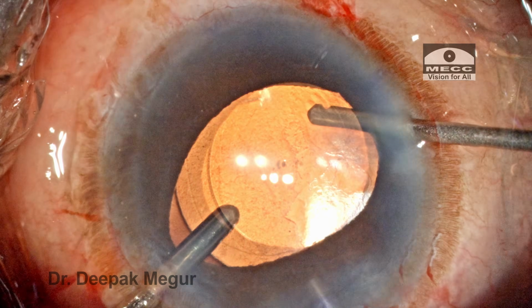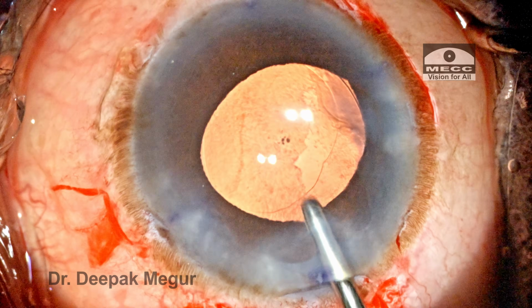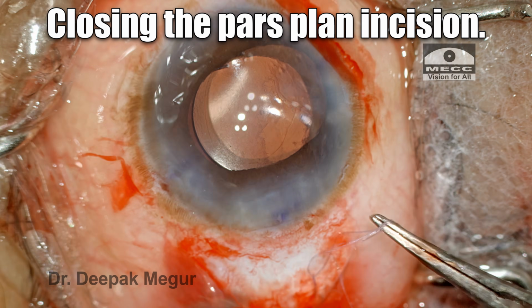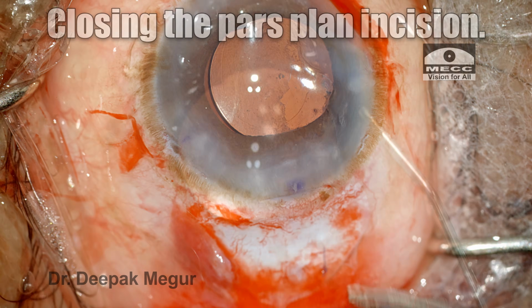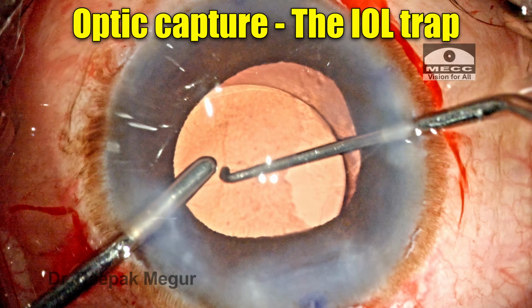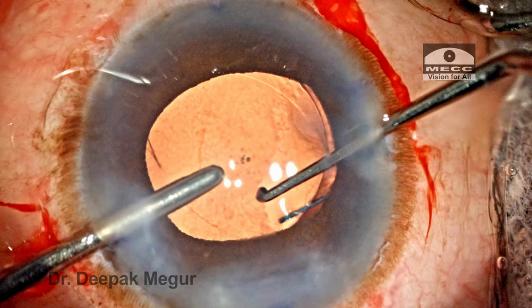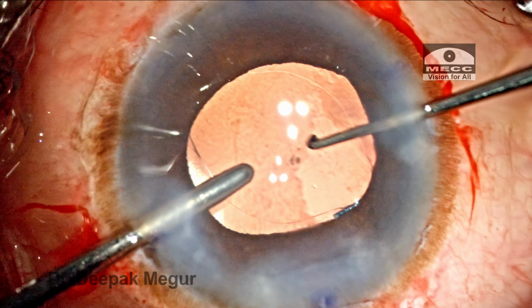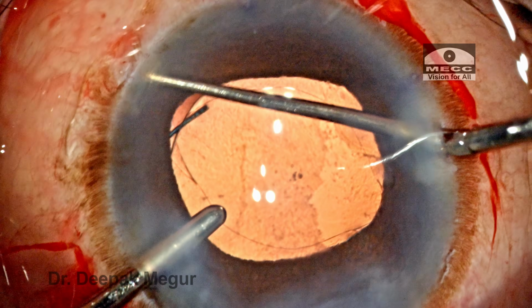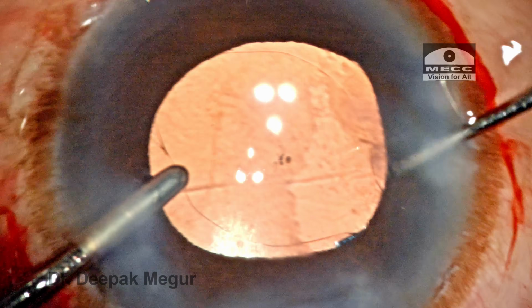So now the OVD and the vitreous have been taken care of. The OVD in front of the lens is now aspirated out. The vitrectomy port is sutured with an absorbable suture. Time to perform the optic capture. With the irrigation in my left hand, the lens is pushed back gently so that we can see the optic sliding behind the rhexis margin. And now ovalization of the rhexis confirms that the optic is well and truly captured.